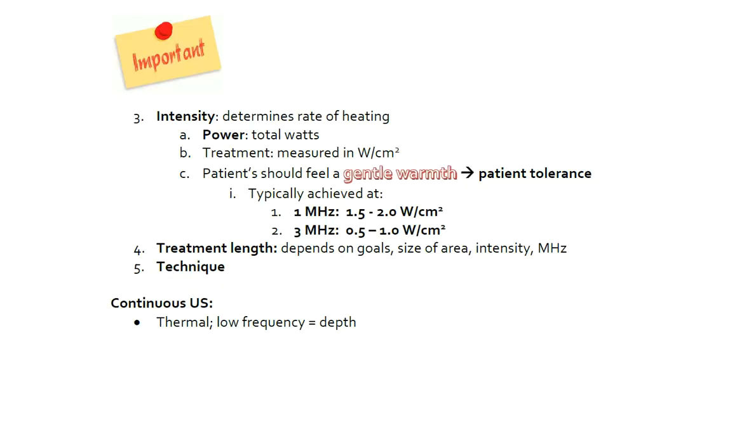Other parameters to know about would definitely have to do with the intensity. The intensity is going to determine the rate of heating. The higher the intensity, the more vibration of molecules, the more thermal effects that occur. This is measured in watts. And as you turn the knob up on the ultrasound machine, you'll see that it's calculated into watts per centimeter squared, at least in the United States. In Europe and other countries, sometimes they measure this in joules, but it's very standard in the United States to have watts per centimeter squared.